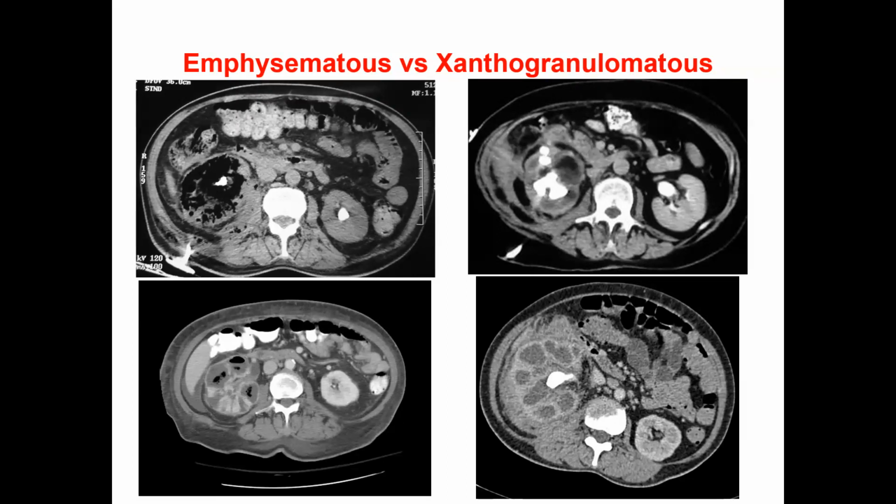Okay, are you clear on this? How to differentiate? We've discussed acute pyelonephritis, striated nephrogram. Don't treat them, they go into hypertension, scarring. Scarring would be loss of nephrons and a lobulated outline. The patient can also develop abscesses. They can also develop different chronic sorts of pyelonephritis. One is emphysematous, which has air inside, and the second one is xanthogranulomatous, which has fat-containing macrophages, fat cells.